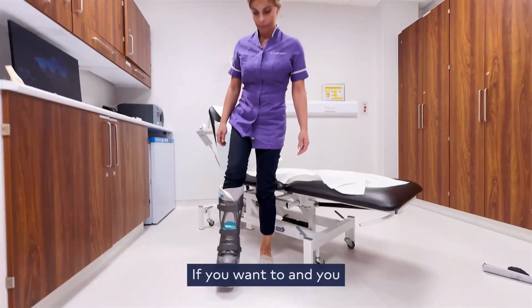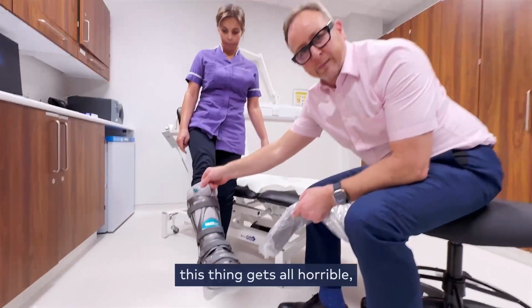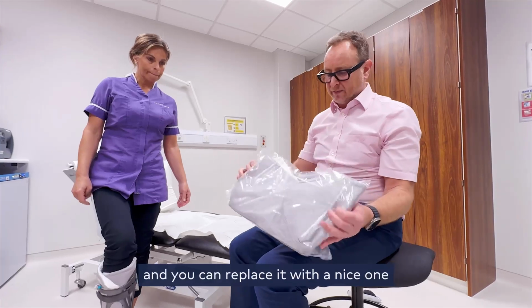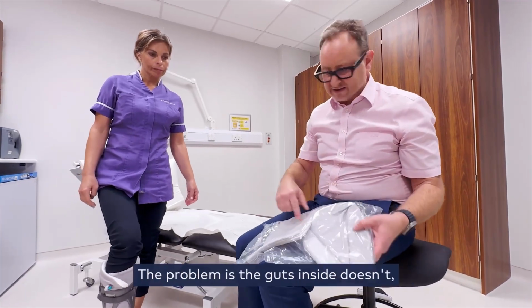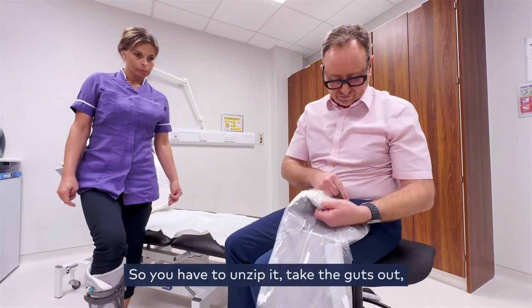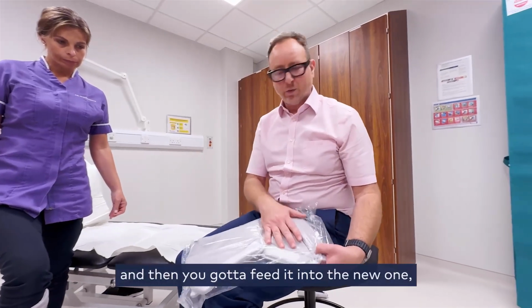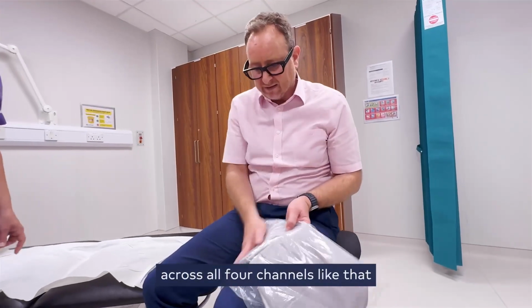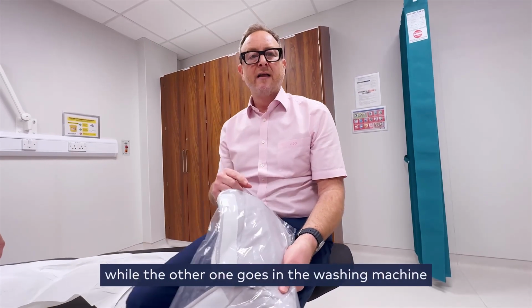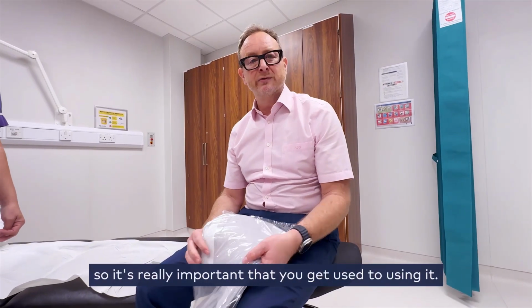If you want to, and I told you before there's a spare one. If it's dirty, this thing gets all horrible because you're going to be in it for several weeks, then you can take this off and you can replace it with a nice one that can go in a washing machine. The problem is the guts inside, you don't get 2 guts. So you have to take the guts out. So you have to unzip it, take the guts out, which is a bit of a palaver, and then you've got to feed it into the new one across all 4 channels like that, and then close the zip, and then you've got a nice new clean one while the other one goes in the washing machine for next time use. You're going to be in this for potentially up to 12 weeks, so it's really important that you get used to using it.